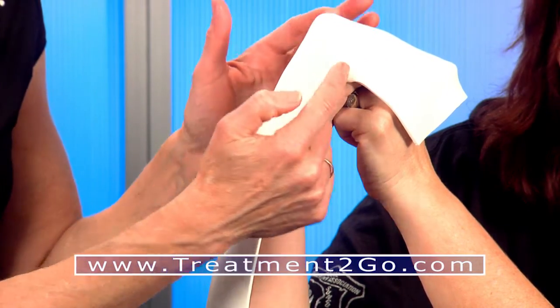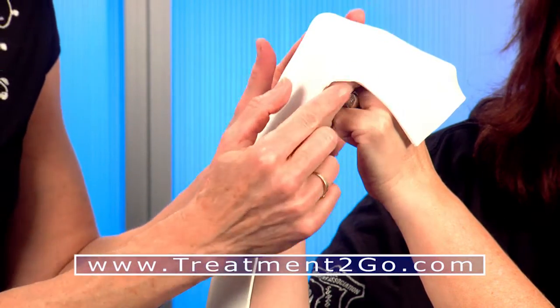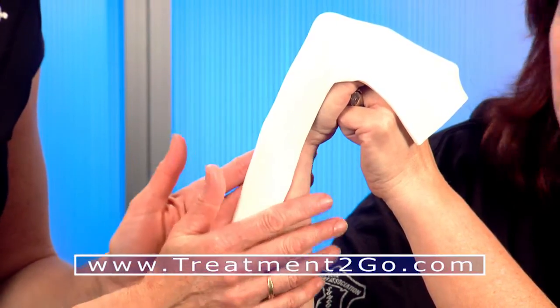The fact that it conforms so well at the MCP joints means I no longer need to do any pinching or dog ears, as they're called, in order to make the material bend right here. It molds really well.